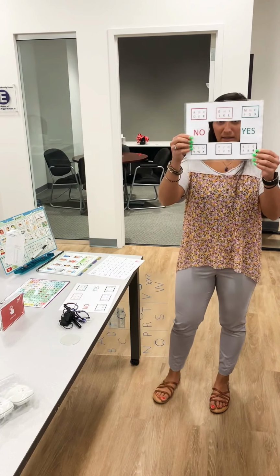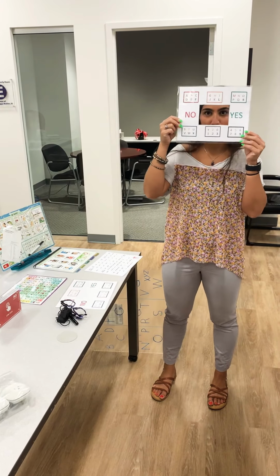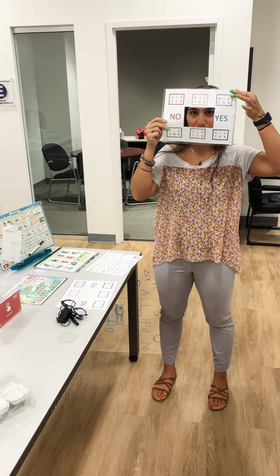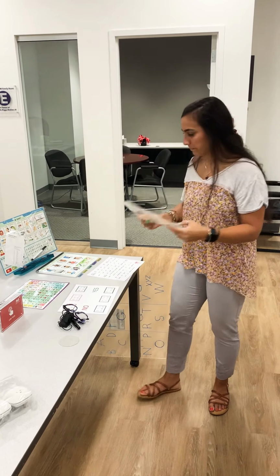Another option is something like this. So on both sides we have the same thing. If you put your eyes through here and you look up to the box, what I'm looking at here is the same one over here. So we'll indicate to the person you're communicating with what you want to say.